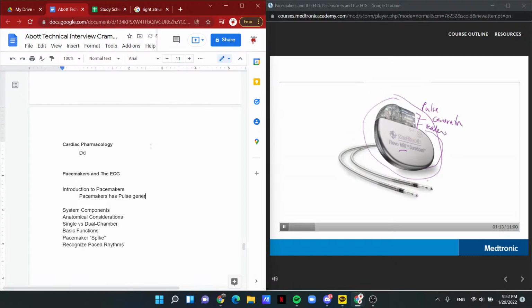The wires, otherwise referred to as pacemaker leads, attach to the inside of the heart muscle either passively with a tip that looks kind of like a grappling hook, or more commonly there's an active fixation mechanism that looks like a little tiny corkscrew. Now, for the most part, pacemakers are used to treat bradycardia, so either sick sinus syndrome or AV block will be an indication to use a permanent pacemaker.